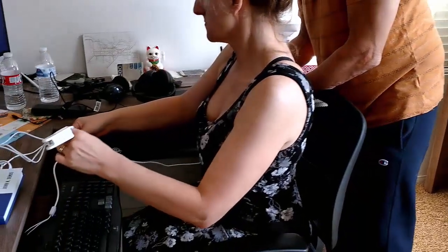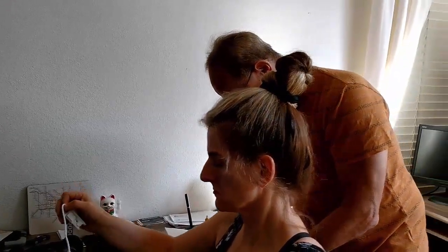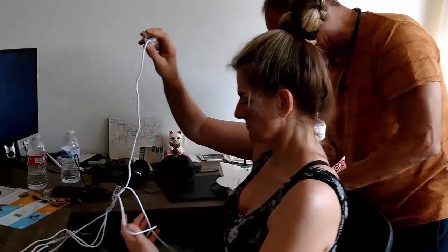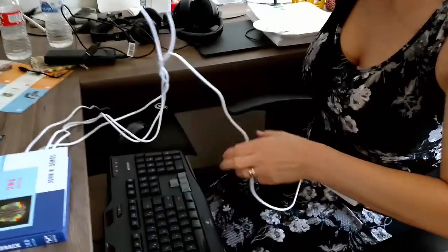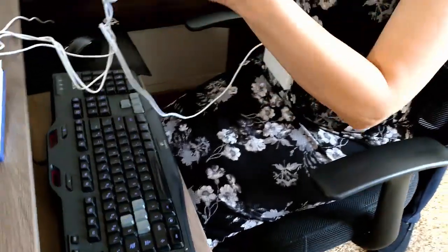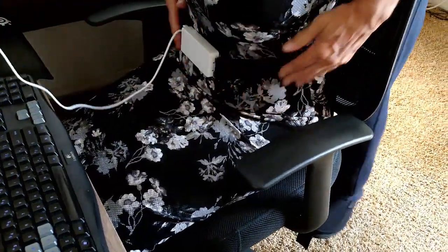You know, if you're in the CIA or something like that, you've got to go through this all the time. And the strap has to go around her abdomen, so that it's snug and measurable. Is that okay? Oh, yeah. Okay, I'm going to make it a little snugger, like that. That's fine. Is that okay? That's good. Okay, so now we're going to put that there.